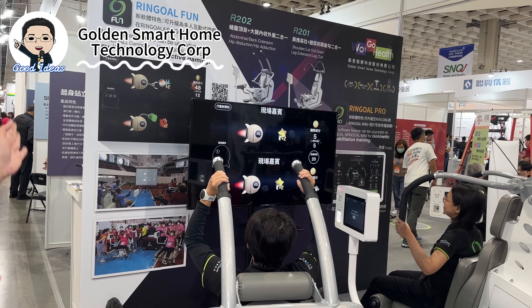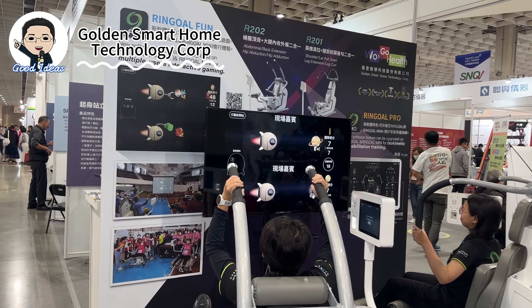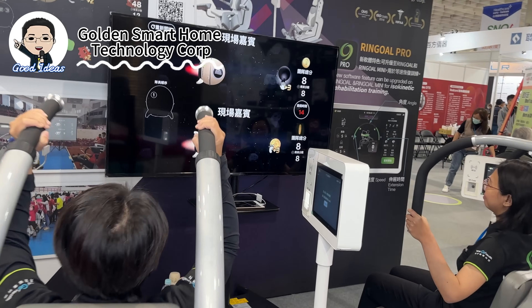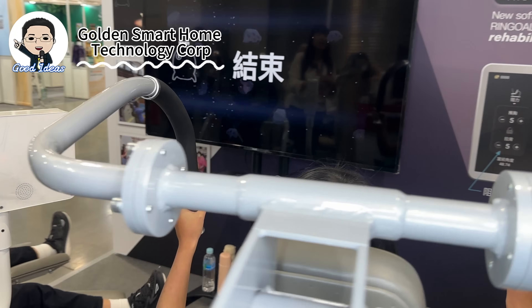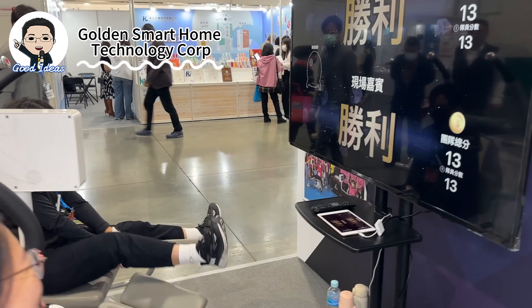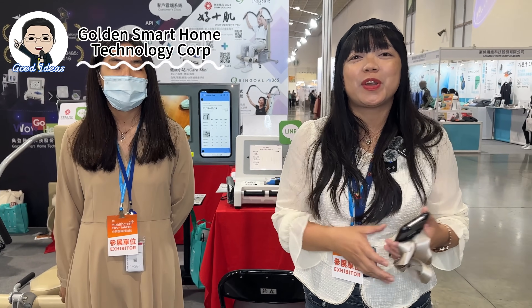When they see the star, they have to use their foot to kick the ball. They have to use their hands to kick it out. So it's training for brain and eye coherence, and also for recognition exercise.